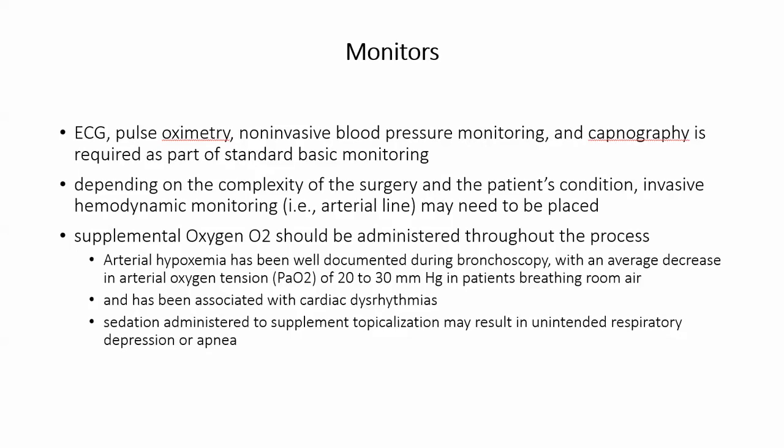Managing a difficult airway also includes monitoring the patient's ECG, oxygen saturation, non-invasive blood pressure, and capnography. Depending upon the patient's condition and comorbidities, invasive hemodynamic monitoring may be considered and may need to be placed prior to awake intubation. Supplemental oxygen should be administered throughout the process.